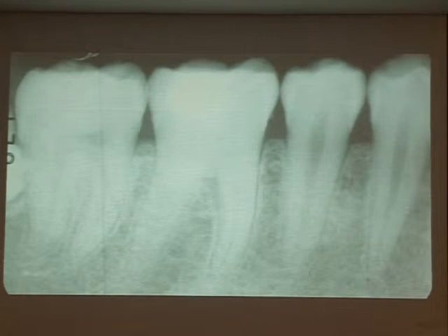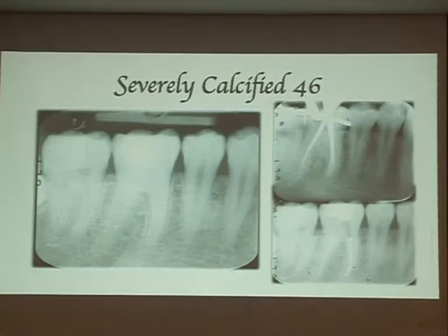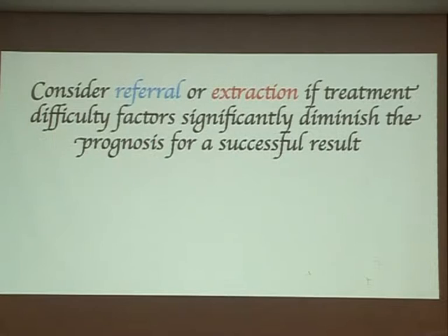Okay, I don't want to commit, but the patient is in pain and is young, only about 20 years old. I don't know what the classification of the pulp chamber is, but the case comes to me, and I need to do endo. So it's quite a difficult one. I spent 4 to 5 hours working on this tooth, a lot of time to look for all these canals and finish the case.